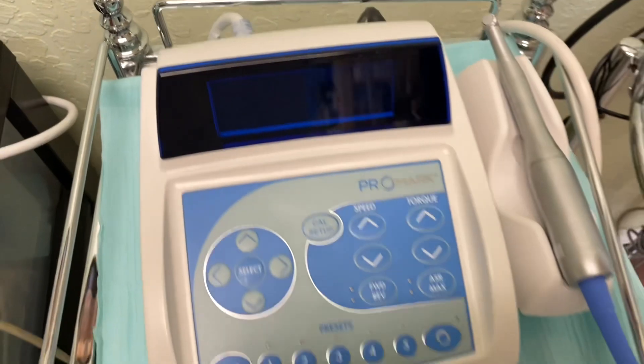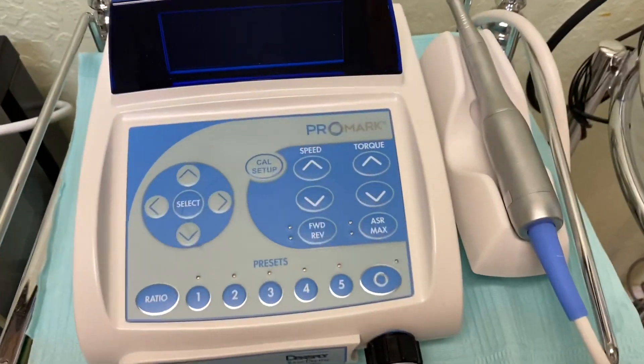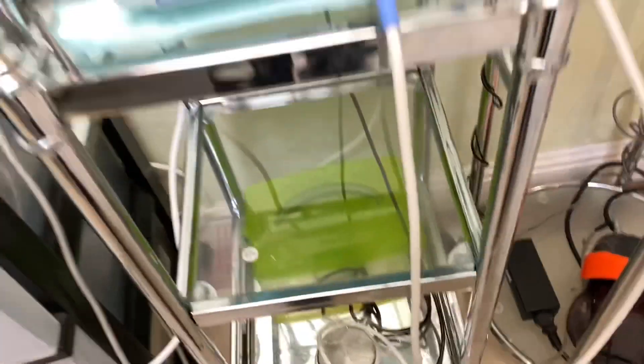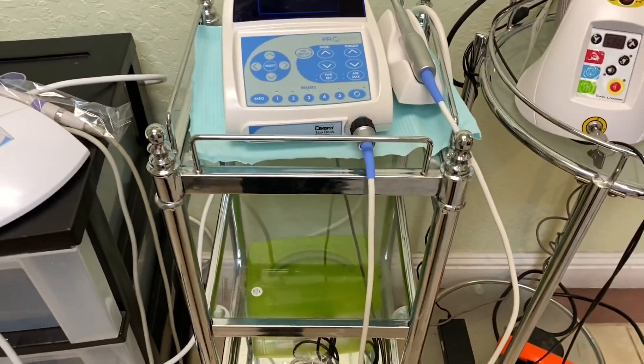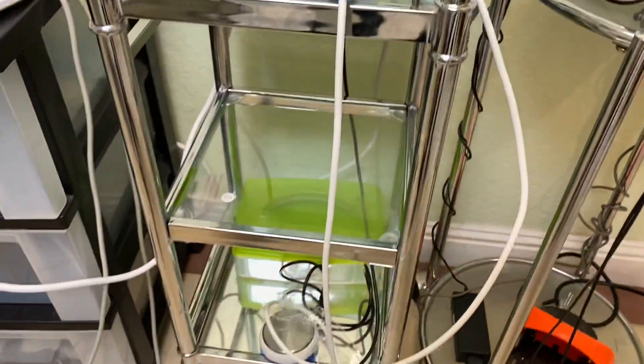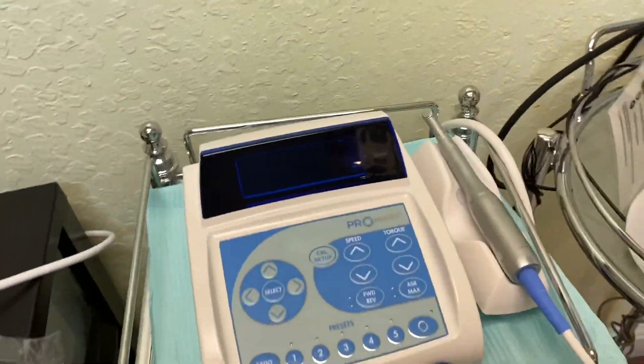Let me show you the machine. It's so simple — just this little tiny machine, a little paddle, and you can pretty much set up your office with this unit and you're ready for endo.